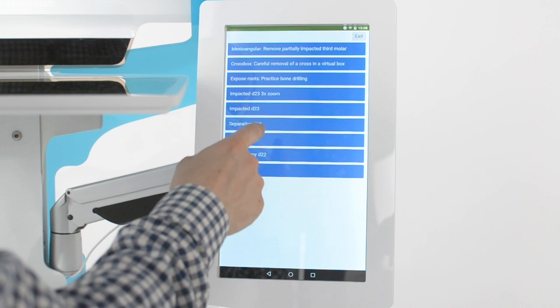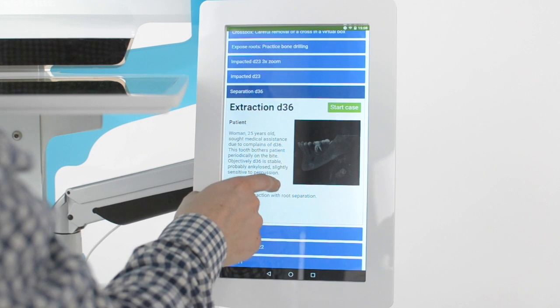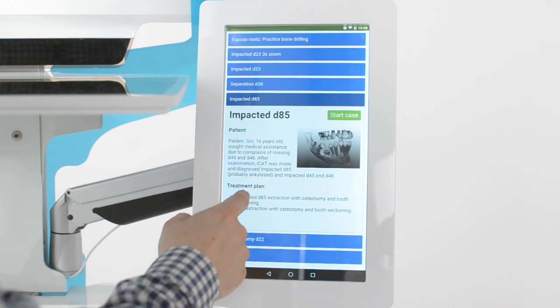Here on the side screen I can select among several patient cases, each derived from a real scenario. Here is one case where a 16-year-old girl sought medical assistance due to complaints of missing teeth.